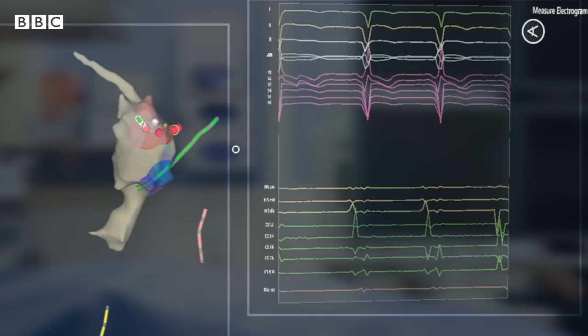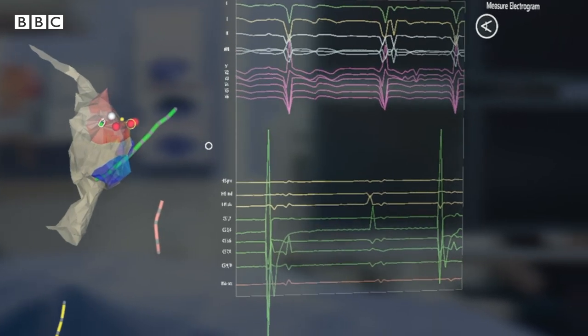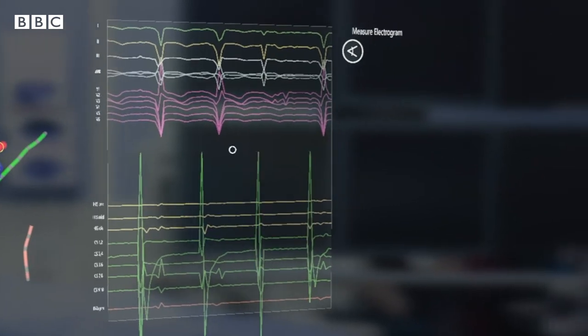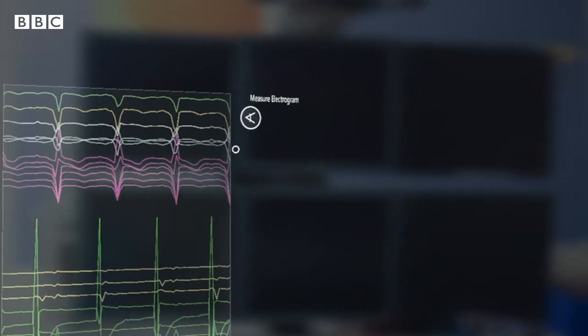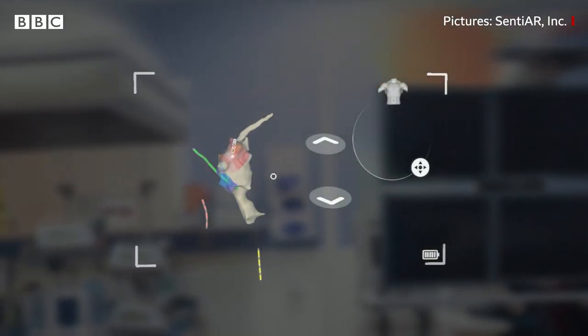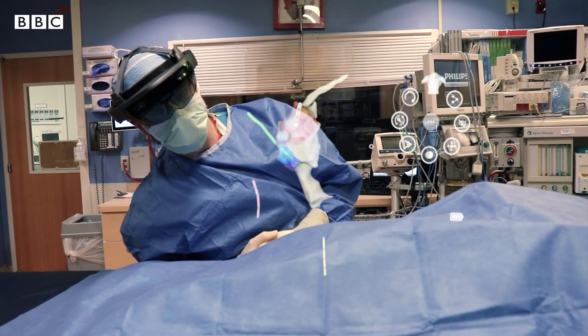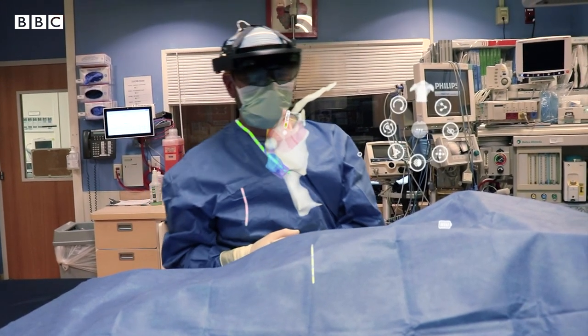And we do that by connecting it to a system known as an electrical anatomic mapping system. Those have been around for a while, but everybody's been looking at that data on two-dimensional screens. They haven't had it right in front of them in 3D, where they can control it and turn it left and right and up and down, and even just move their head around the corner to see another side of it in a very intuitive way.